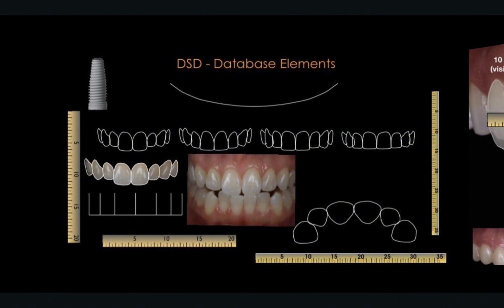And so we then move into the 2010s up until around about now, where digital smile design hit the mainstream, where we moved from that analog digital hybrid to pure digital workflow. I'm sure there are some people out there who look fondly at these shapes and rulers, this database of elements that DSD came out with in the early days.